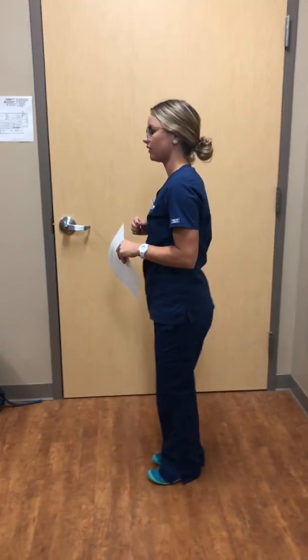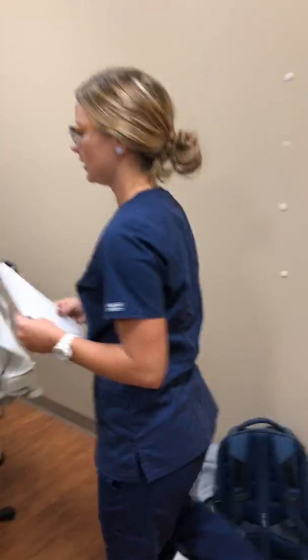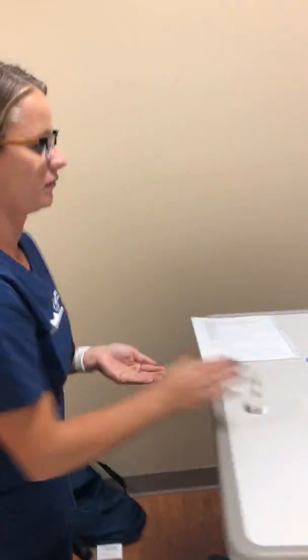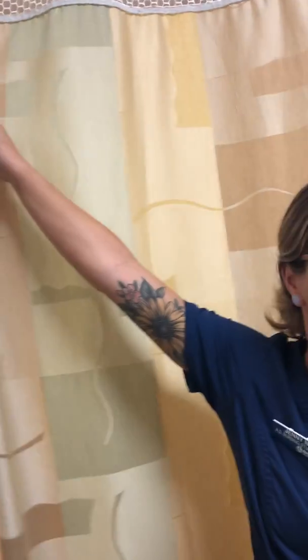I'm going to gather all my supplies outside the room. Once I have everything prepared, I'm going to head to the room. I'm going to knock on the door. Knock, knock. I'm going to hand sanitize my hands. Washing my hands. Pull the curtain closed for privacy.